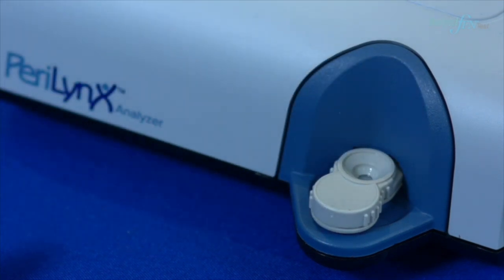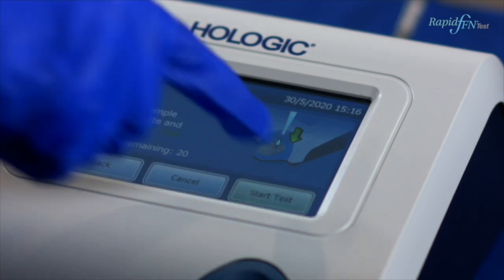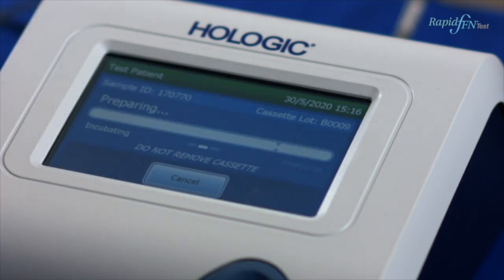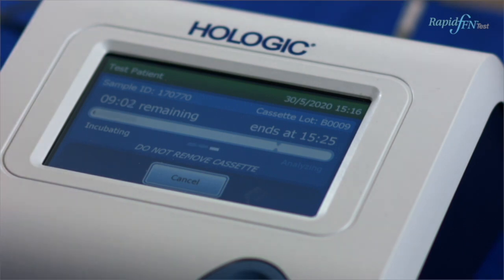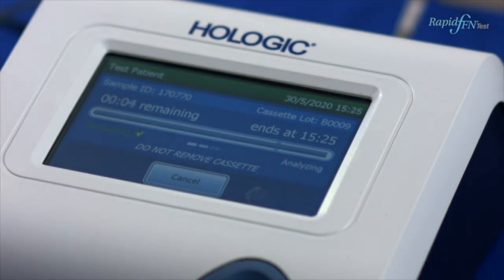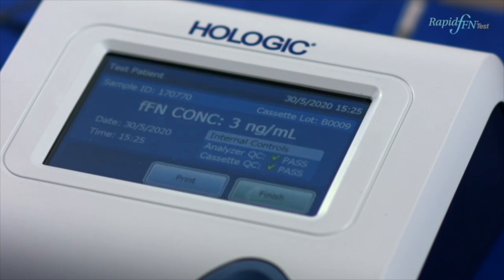You will notice that the screen tells you how long is remaining before the result is available and what time you can return. At this point, you can walk away. When finished, the patient result is printed. Press Print for a second copy if required.